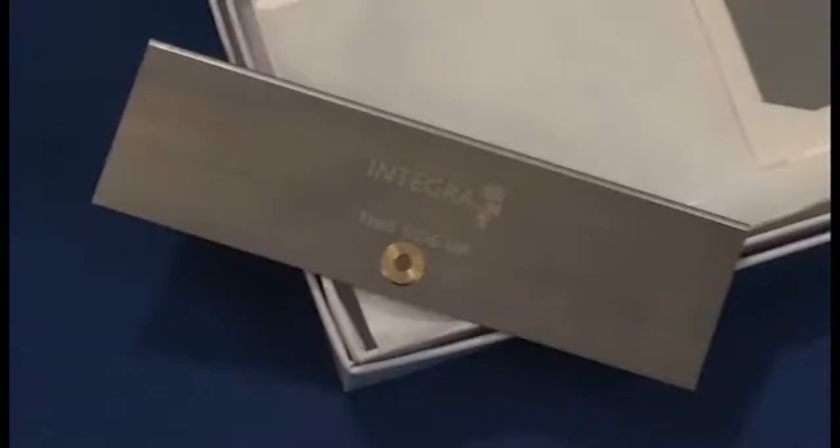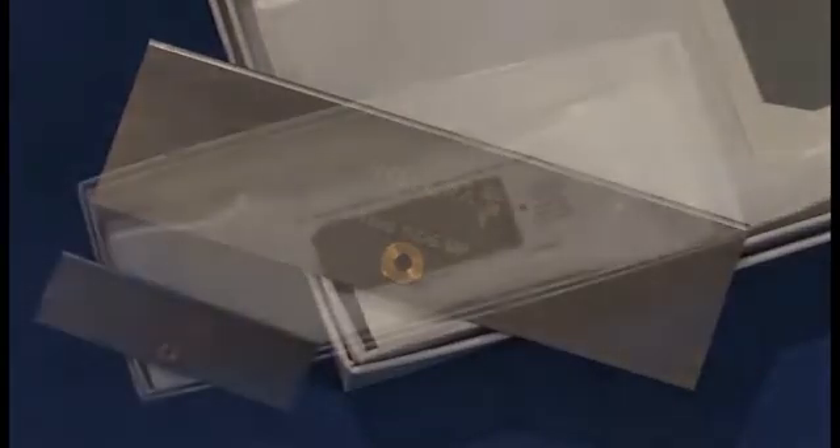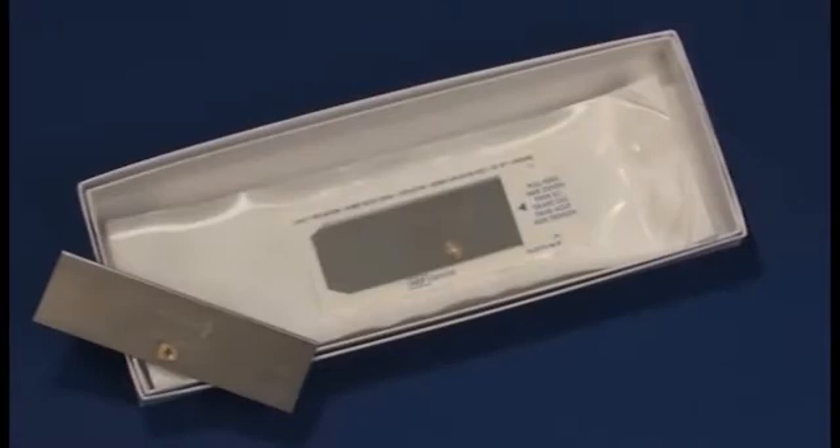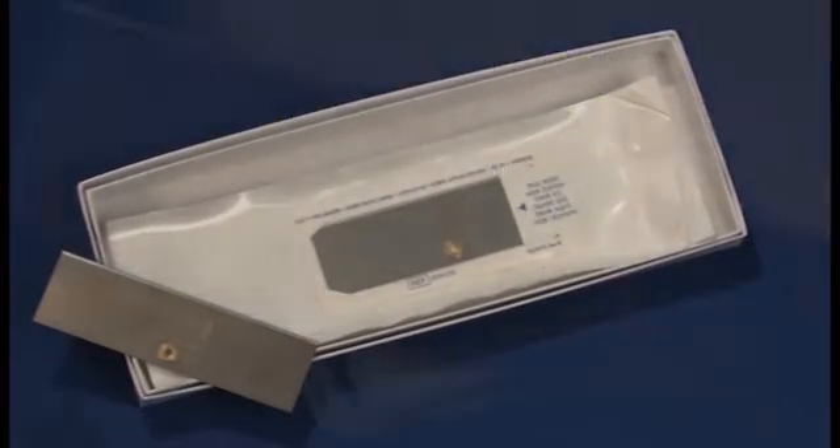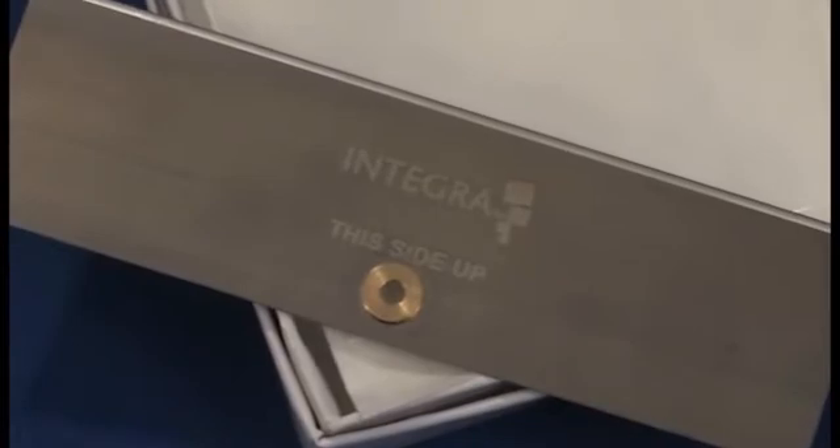Blades for the Integra dermatomes should be ordered separately from Integra Life Sciences. They come in boxes of 10. Caution! These boxes contain very sharp blades that could cause injury if handled without care. The sterile blade is capable of cutting through this package and inflicting injury.